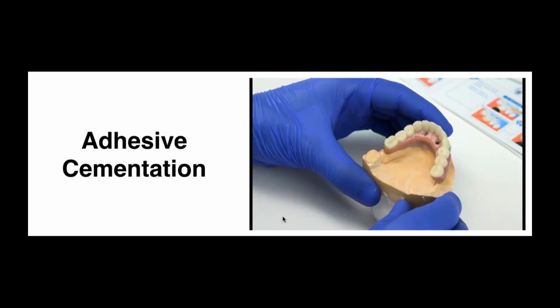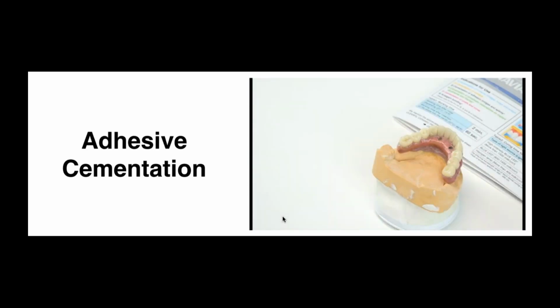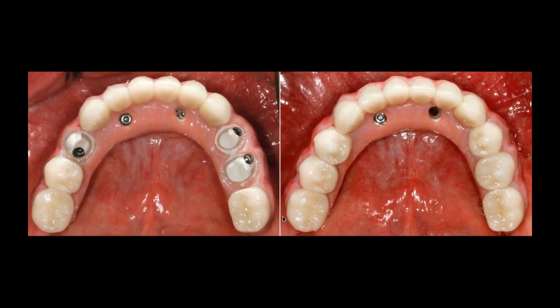Of course, the ones that have the screw access, if they are made with hybrid ceramic, I would not create a screw access hole directly to this restoration with a handpiece, okay? Because this has 86% feldspathic ceramic, so the material would be affected, okay? We go ahead and finalize the restoration. We already bonded this to the Ti-bases, of course, non-engaging titanium bases for this type of full arch case. And then we go ahead and deliver intraorally those 3 crowns, and then torque everything and cover those 2 screw access holes with the pink composite.